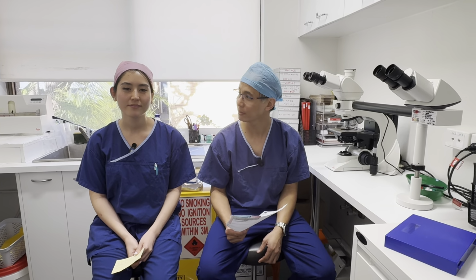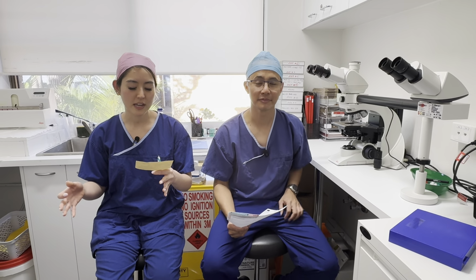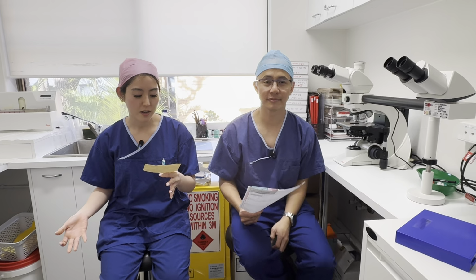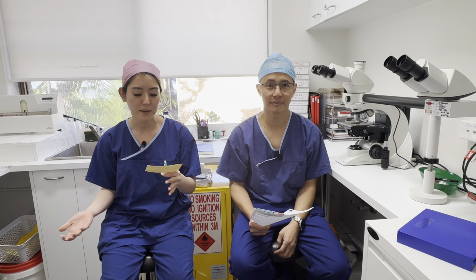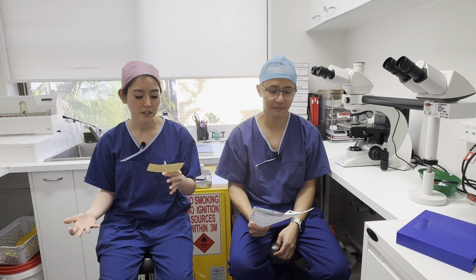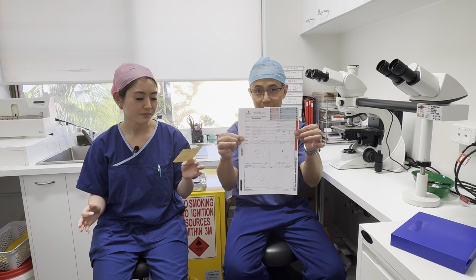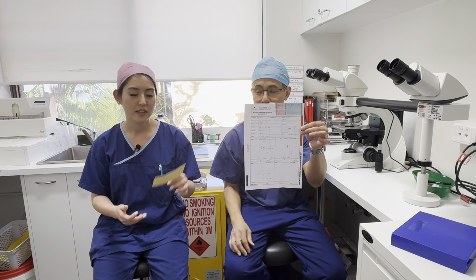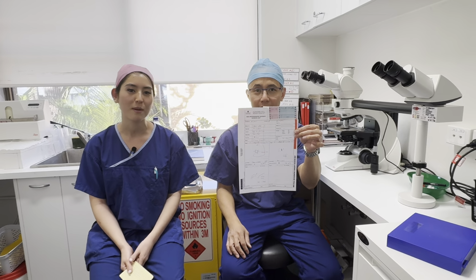So now from the PowerPoint that we understand what Mohs surgery is and what it involves, it's important to gain insight into how the tissue is excised and mapped, what the mapping represents. So in front of all of us, we all should have a copy of this sheet, which is a Mohs map from our lovely patient. Our patient is John Smith. Dr. Fan will go through the Mohs map with us.